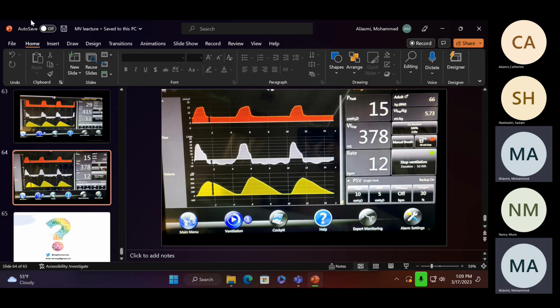How do I know if this is sufficient flow for this patient? That's my question. How could I know this flow is appropriate? Do you know from the back they said flow starvation? What does flow starvation mean? It's the same as work shifting. The names just changed, because it's not always flow starvation. If my patient is starving for flow, he will try to do more. You will see the PMUS during inspiration and expiration. If the flow is normal, but I increase the flow to 60 and the patient is still doing it, I know it's not flow starvation, there's something else going on.